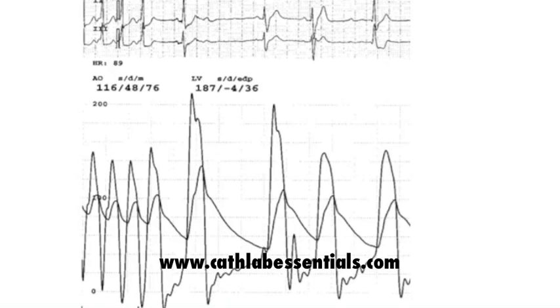Here is a patient who has an unusual association with aortic stenosis. Note the marked decline in aortic pressure matching the rapid rise in LV end diastolic pressure on the middle beats. The aortic pressure falls and is now nearly on top of LV pressure. This is a patient who has both aortic stenosis and marked aortic insufficiency. Aortic insufficiency is characterized by a narrow end diastolic pulse difference, a large pulse pressure, and a rapid increase in diastolic filling across the diastolic filling period of LV tracing.